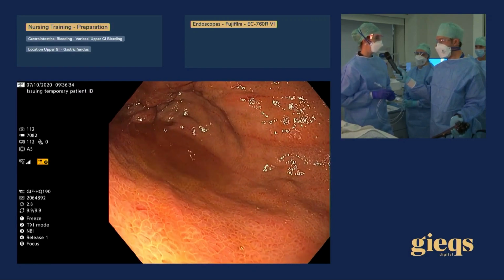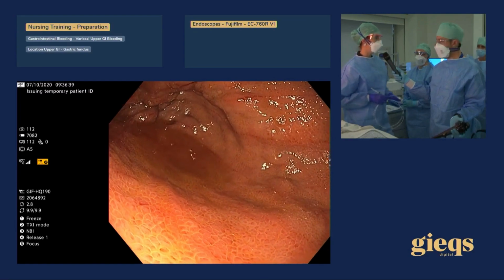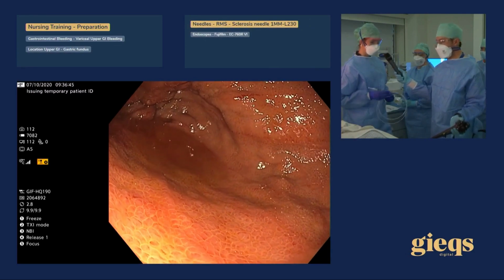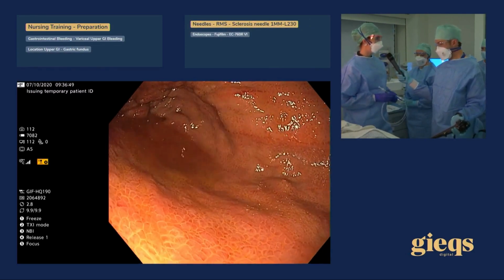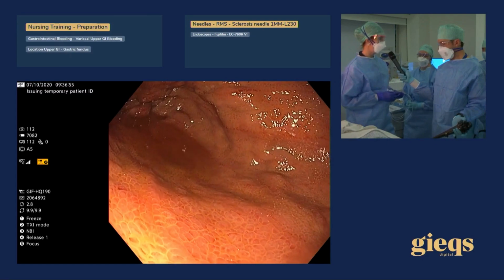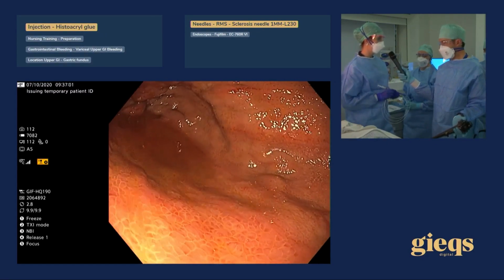If we do it now, before we go into our scope, it gets rock hard and we cannot flush it anymore. And we break the scope, which is what we don't want to do. So this is pure lipiodol. We go in. Talita, my colleague, when we enter, will make a new syringe with lipiodol and histoacryl. When she is ready, we have to be in, so we can inject it right away. So we'll show that now.